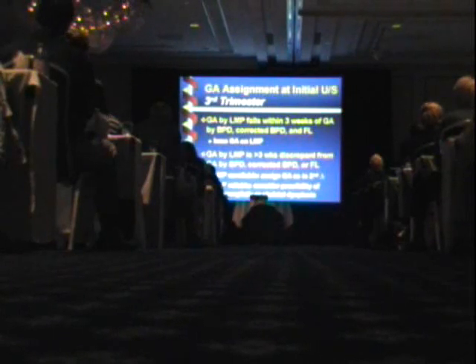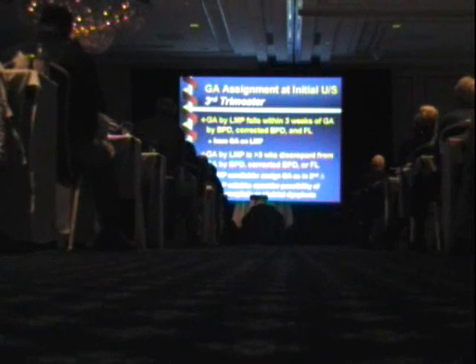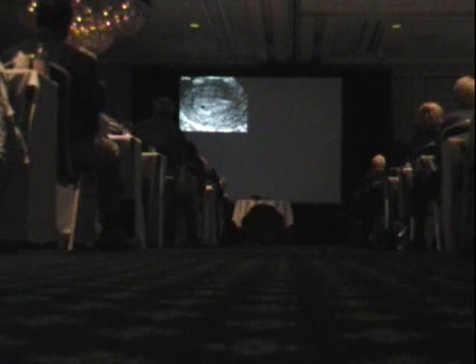We have a discrepancy. And then there's no one rule. We have to question the woman carefully about the reliability of her memory of her LMP, find out if she had an ultrasound done somewhere else that might be helpful, and so on. When it's a third trimester scan, first scan, and there's more than a 3 week discrepancy, we have to really dig into the situation a little more specifically. Just some examples of all of this in terms of pictures instead of tables.